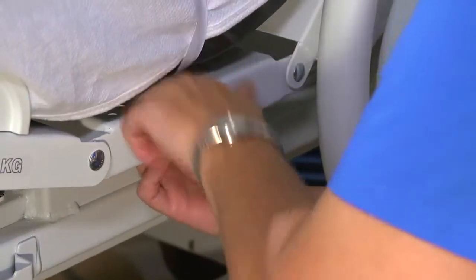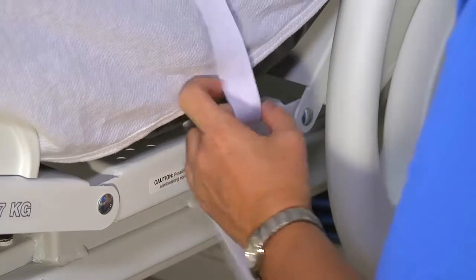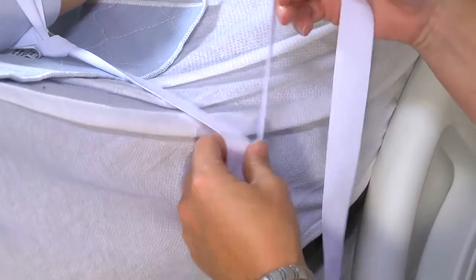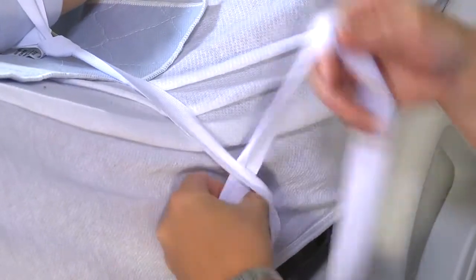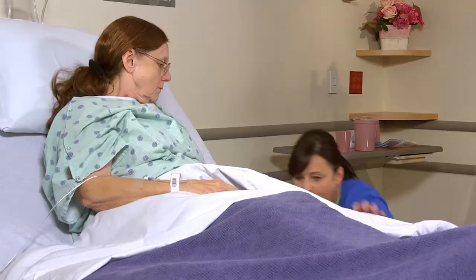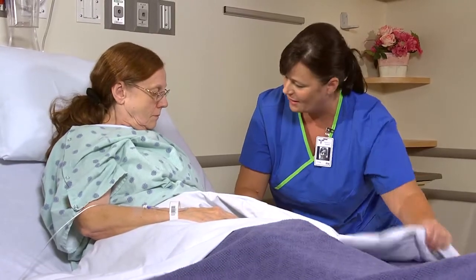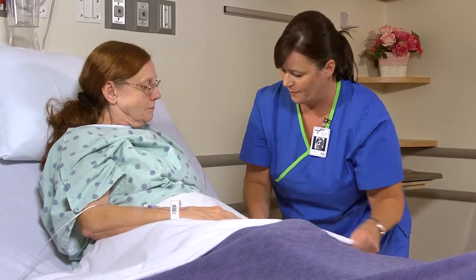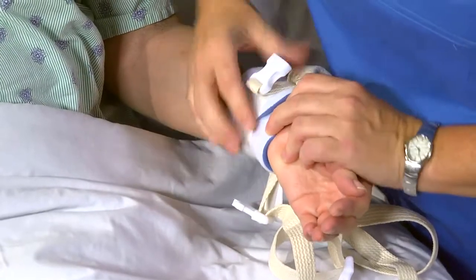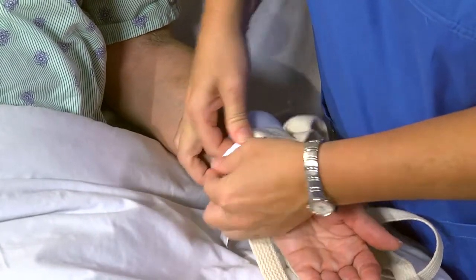Use a quick release tie to secure the restraint to the stationary part of the bed frame. Restraints may also be attached to the frame of a chair or wheelchair, as long as the ties or buckles are out of the patient's reach. Alternately, you may have restraints with quick release buckles both for securing at the wrist and at the bed frame.